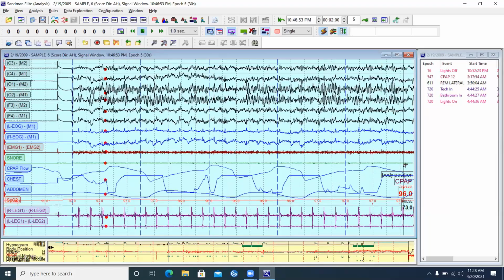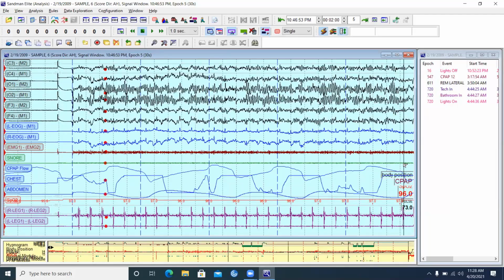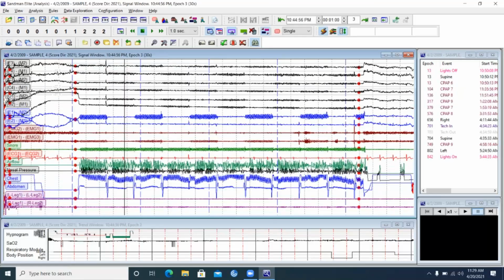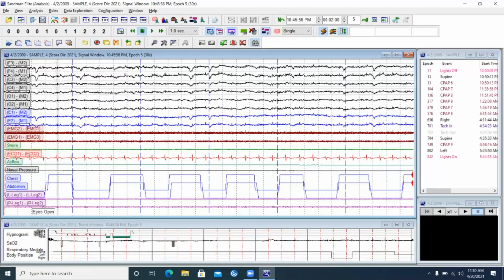And then once that's done and your signals settle out, we do biocals. Essentially, there are a series of calibrations that we do with our patients to test the integrity of the signals. So there's the amplifier calibration. There's the impedance recording. It doesn't really matter what you do first, as long as they're recorded as part of the study. So you can see the tags on the bottom. That's where, when you tell the patient to do it, you mark it as part of the study.